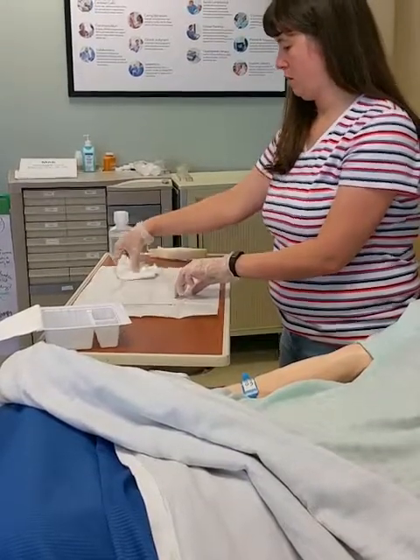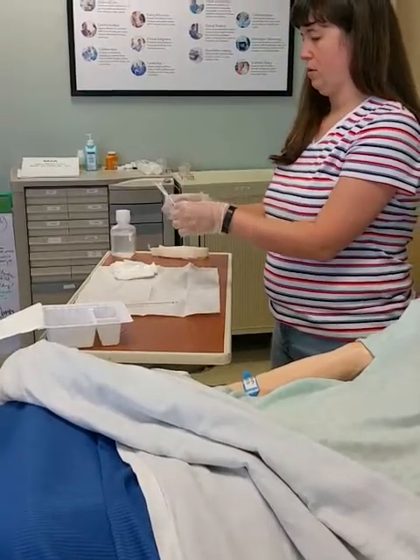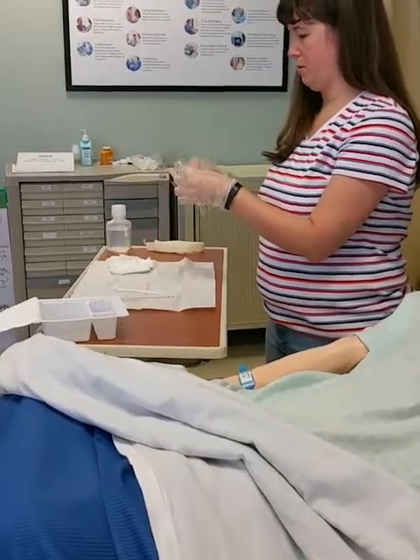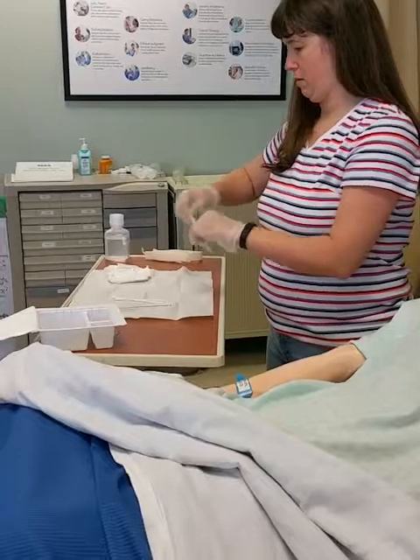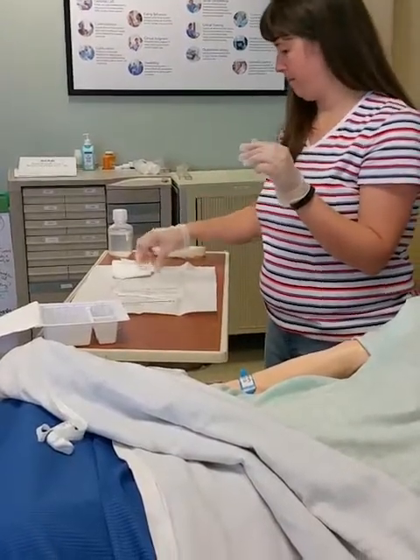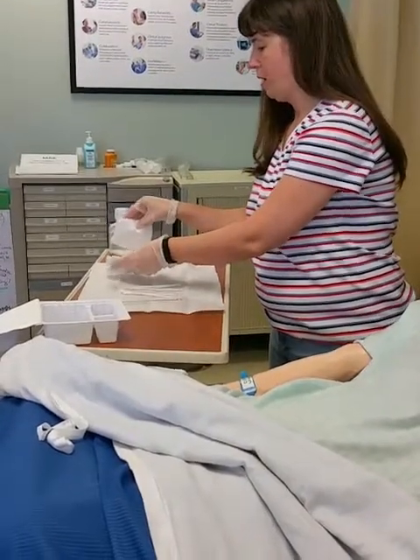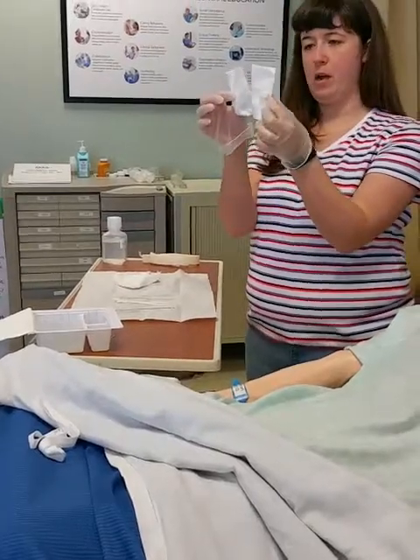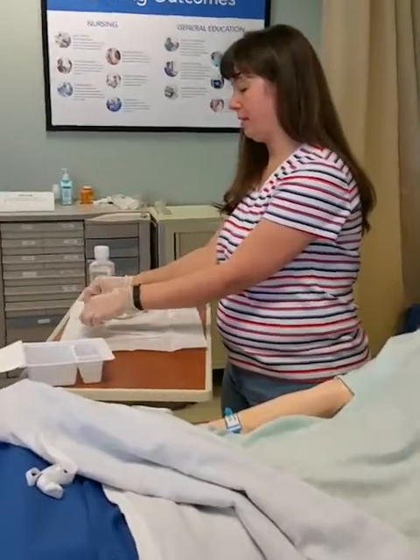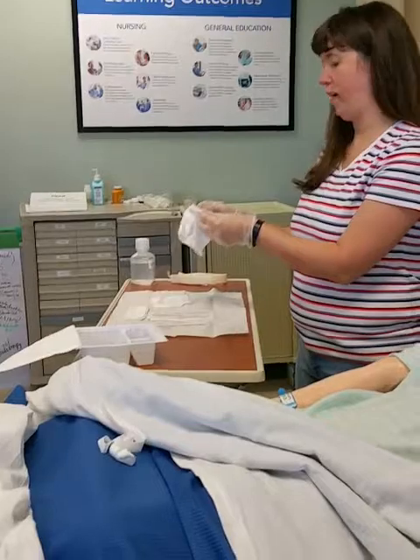Brush. You'll have 2 Q-tips, 2 pipe cleaners. Just fine together. These are old trach ties. You can just throw those away because you don't want to use those. Okay. Now you have one piece that's what we call split gauze that goes up under the faceplate. Make sure you sit this somewhere so you don't accidentally use it. And then you should have a couple pieces of just regular gauze.